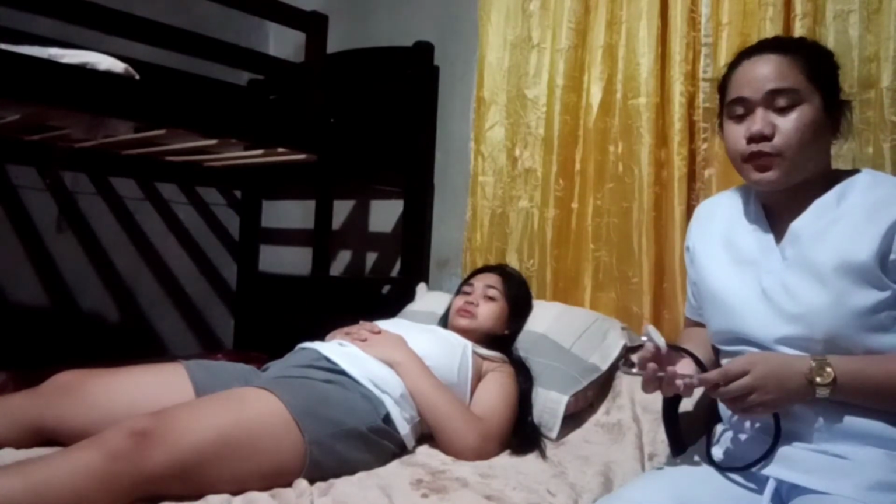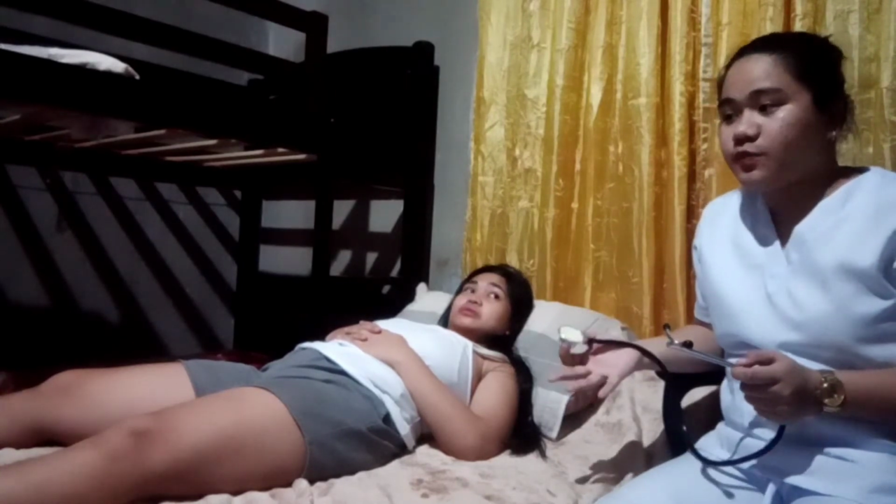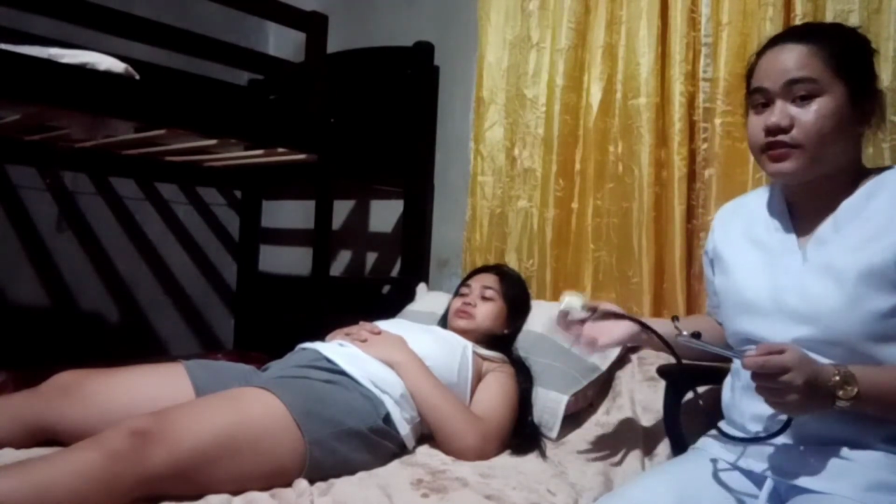Okay, so her pulse rate is 73 beats per minute. Now I am going to auscultate the aortic, tricuspid, and mitral areas for the heart sounds.